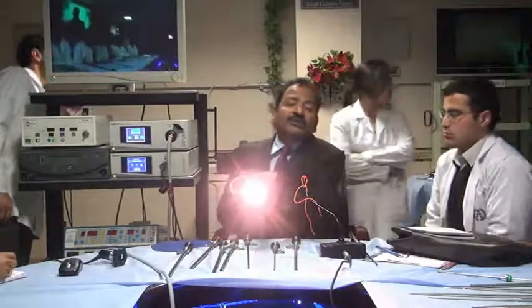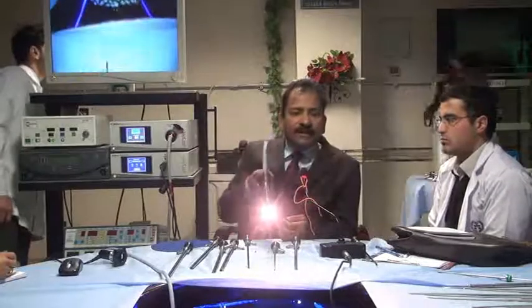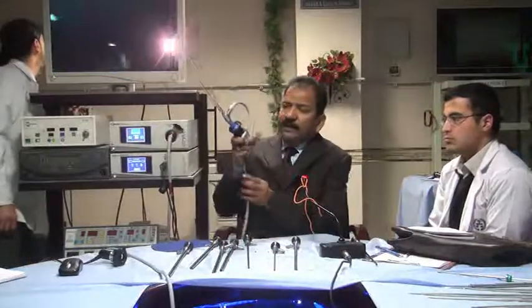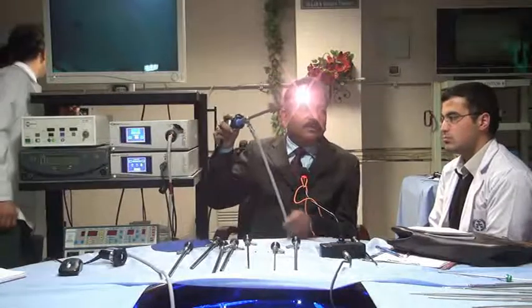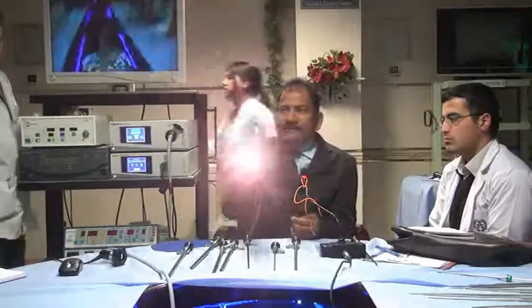If I have to show this stone, I will keep it up. If you have to do a ventral hernia, you have to keep it down. But most of the time it should be up. If you leave it unattended, slowly with gravity it will go down. So the light cable also should be fixed with your hand.